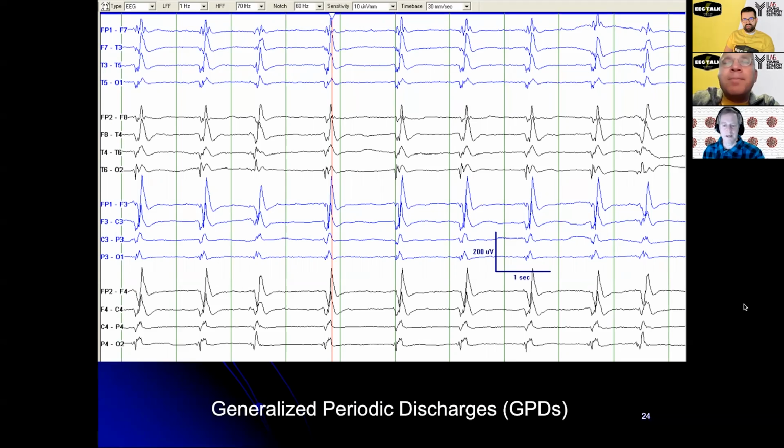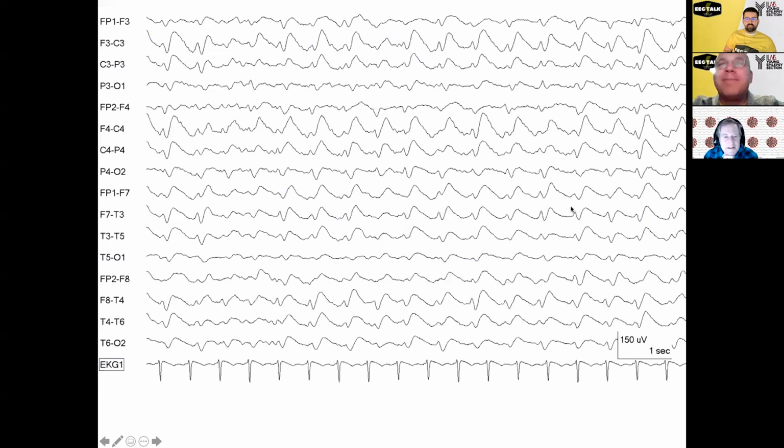Ooh, this is a rare beast. So I'll just pick one channel to make it easier. Just look here at F3C3 for a while. So you see a little sharp wave, then a slow wave, a sharp wave, a slow wave, a sharp, a slow, a sharp, a slow, for six in a row.